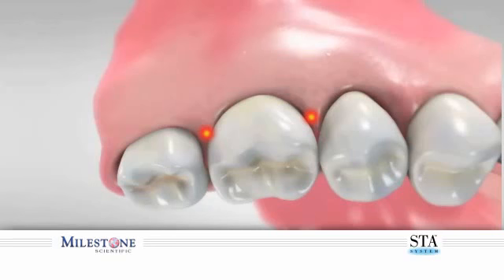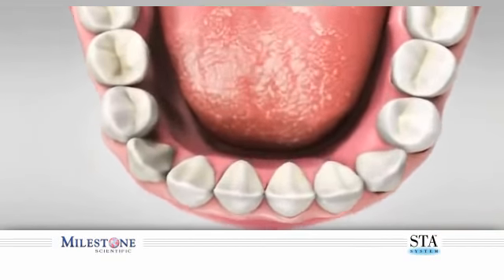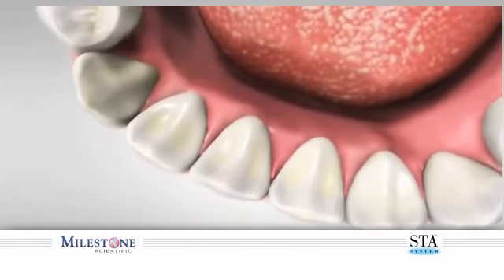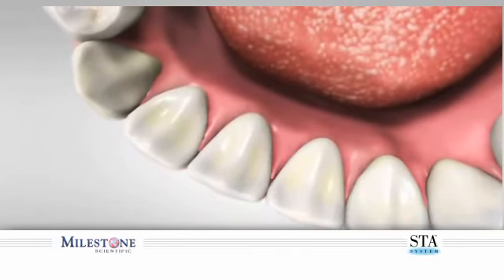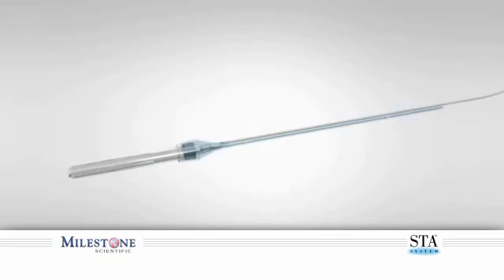When performing an STA-Intraligamentary injection on a single rooted tooth, it is necessary to use only a single site when performing this injection. You may choose to inject into multiple sites on a premolar or anterior teeth, as this is optional. It is important to have direct vision of the needle as it enters into the gingival sulcus.